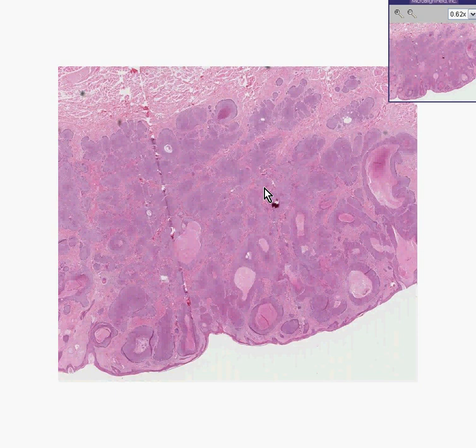Basal cells are without a doubt the most common. Squamous cells usually make keratin in some way, shape, or form, and melanoma is often — usually — pigmented in the tumor cells.